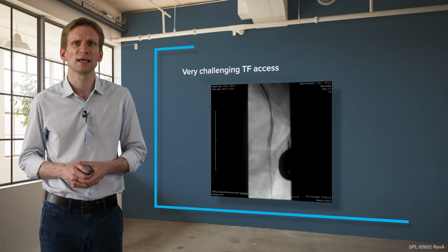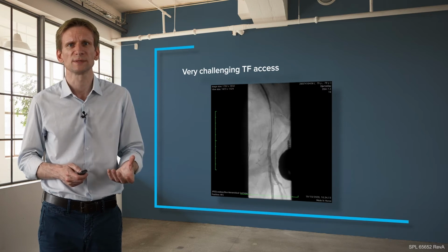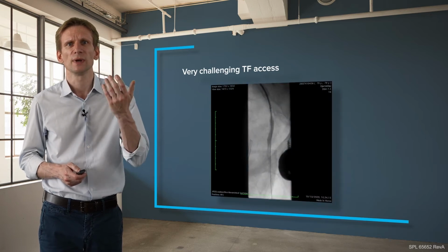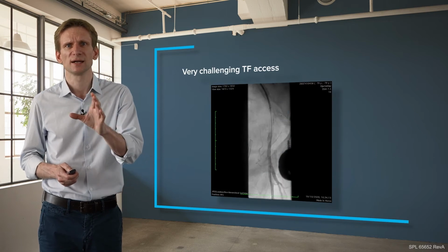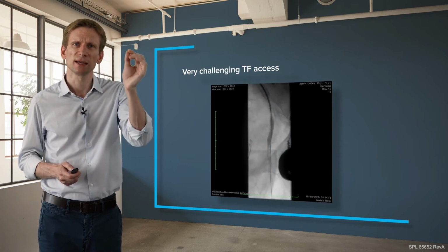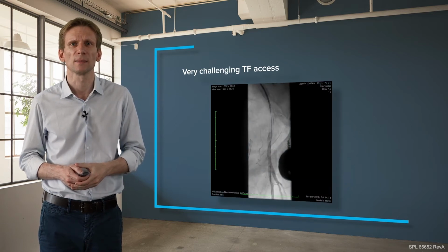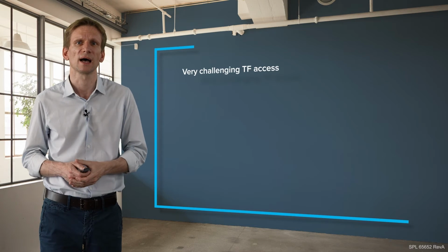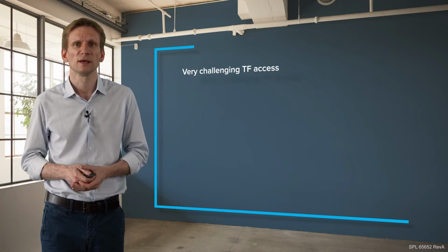And then, of course, at the end, we always do an angiographic control in these particular cases. You see, we had a very nice flow, no complications. Of course, we checked here at the access site, and later on, we also checked on the common iliac part where we did most of the IVL treatment. So this case was completely uneventfully performed and had a very good clinical outcome.